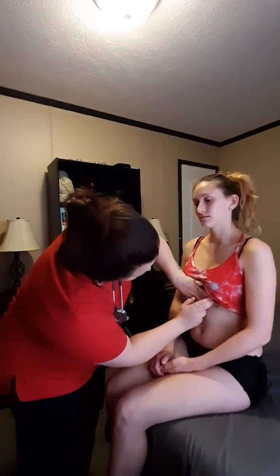One thing to note is with each patient, there is a different amount of checkpoints that you would do, because you wouldn't do the same amount of points on a smaller adult versus a larger adult, or same thing for a child. So it really depends. As long as you are ensuring that you get the entire lung field, then you're good to go.